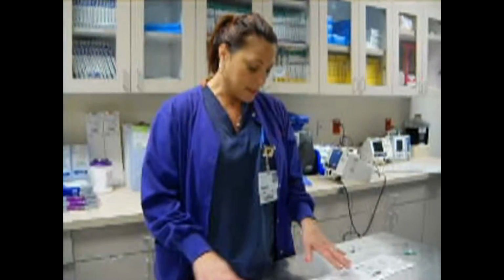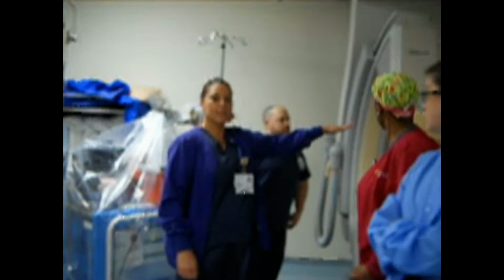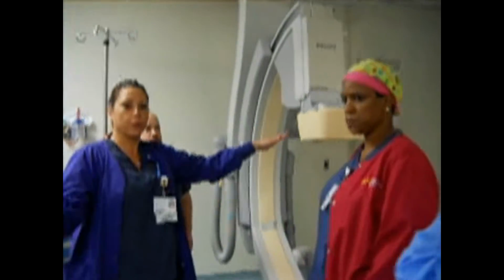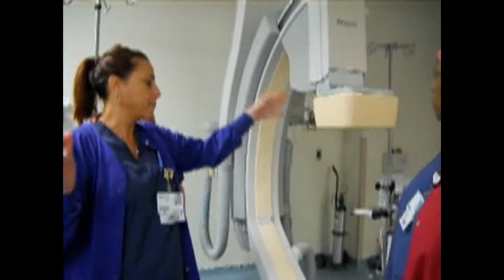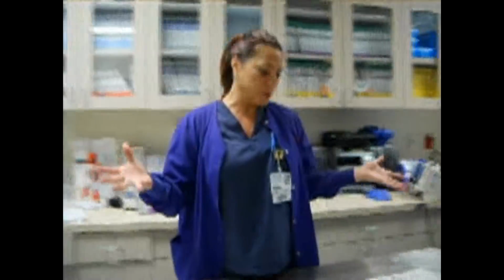This is what we inject the contrast through. And this is our x-ray camera, and it moves in all different views. It moves to the left, to the right, behind you, and above you. The different views just open up your arteries and allow us to see them in all different views.